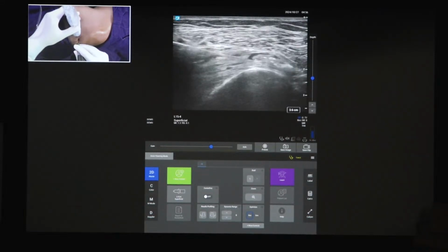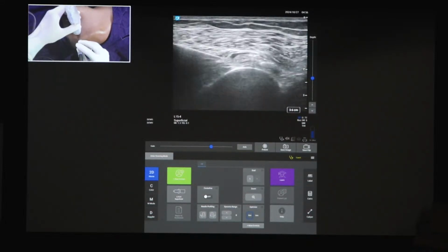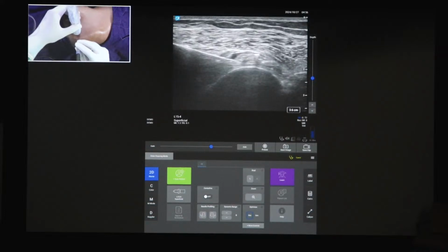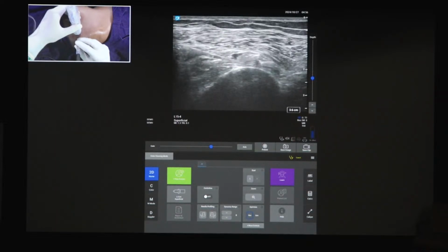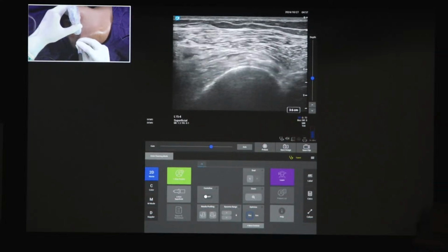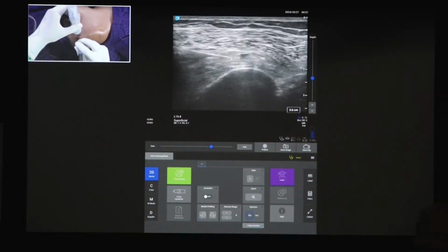So I'm just going a little closer to the periosteum, because the nerve lies very close to the periosteum. Yeah. So again, that is the midpoint of the shaft. So it's confirmed. I'm just going to pierce that fascia, and then we can, I think, start the lesioning.